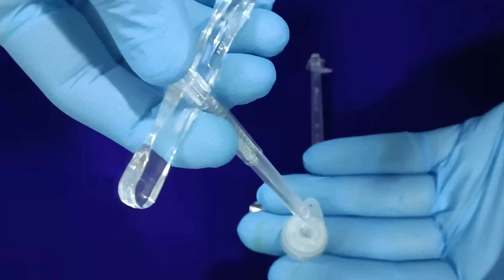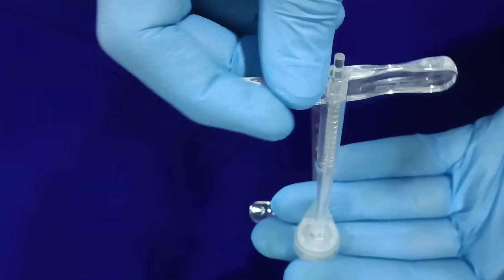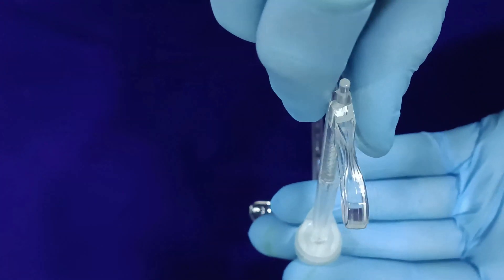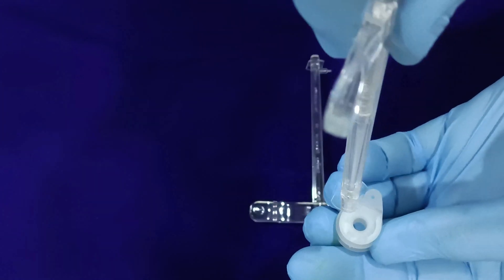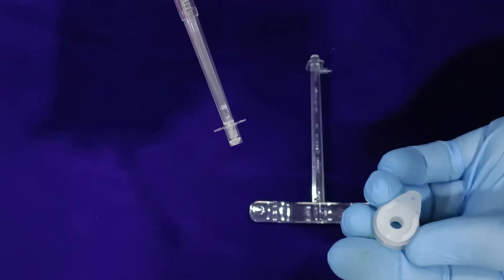Similarly, for removing the inner cannula, repeat the same procedure by inserting the inner cannula inserter that comes with the spring mechanism into the inner cannula by pressing the plunger after synchronizing the structural alignment, and release the plunger creating a locking mechanism. Once locked, pull out the inner cannula from the outer cannula and press the plunger of the inserter for releasing the inner cannula.